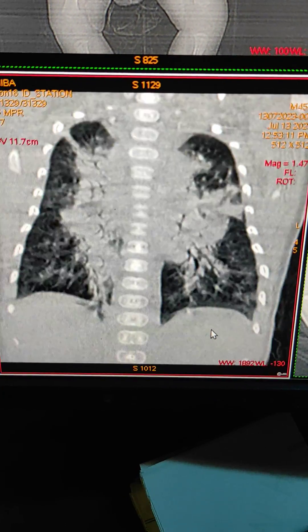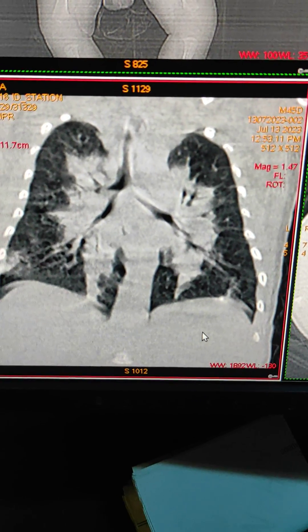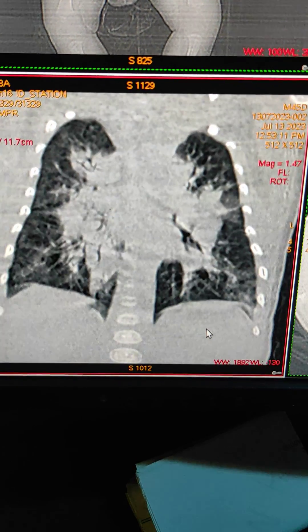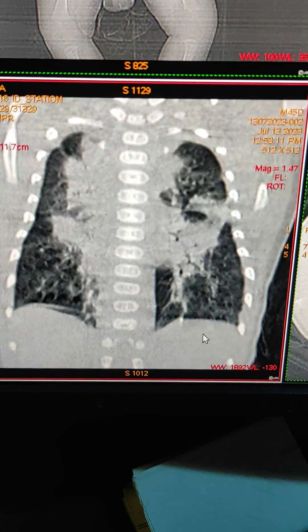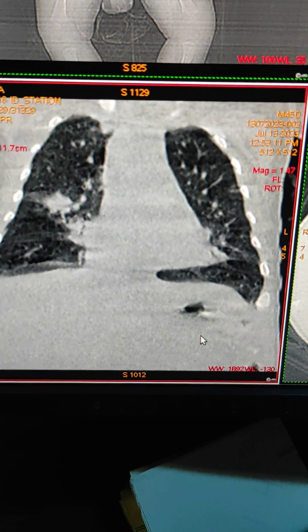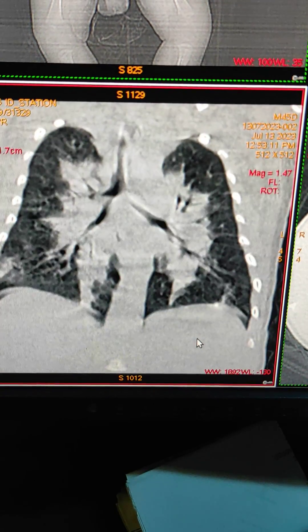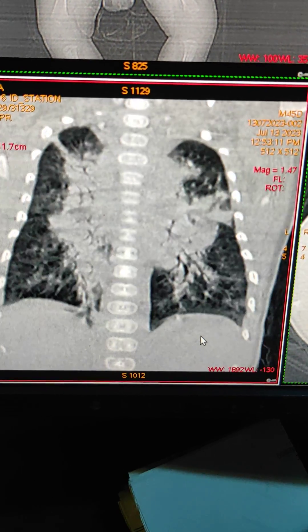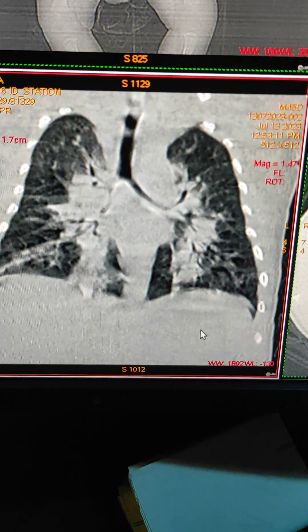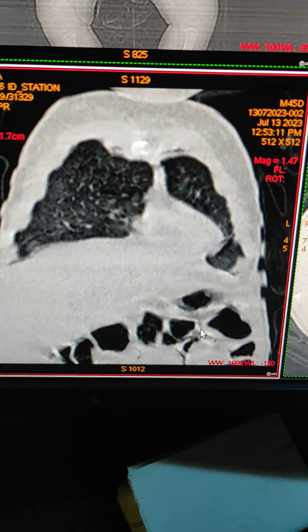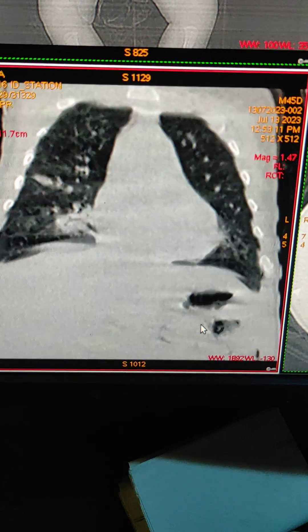The complaint of the patient was breathing difficulty as well as fever. So this is how consolidation looks on a plain scan of the lungs. This is high resolution computed tomography.